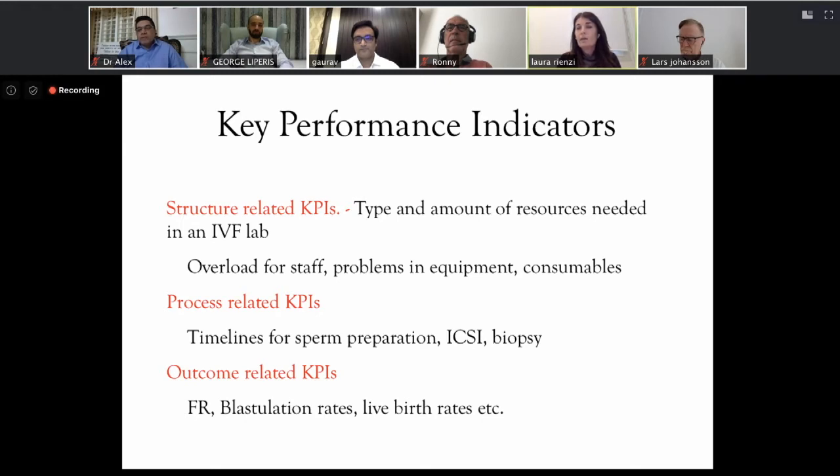So when she arrived in the morning, she had complete hypoxia in the incubator and no alarm was ringing because that kind of incubator didn't have a specific alarm for oxygen. And so we have really controlled every incubator to be sure that they have not only the CO2 control, but also the oxygen specific alarm.